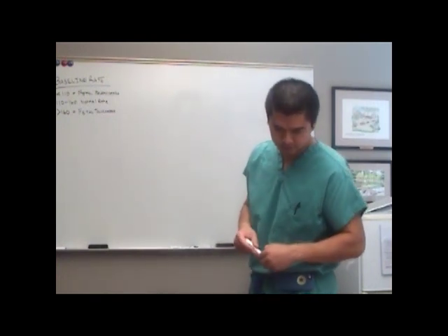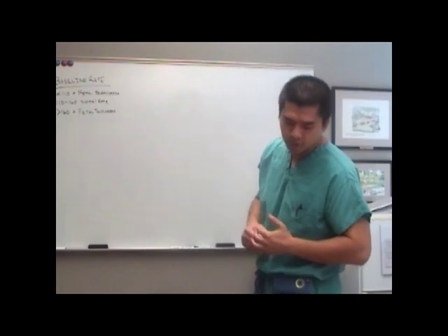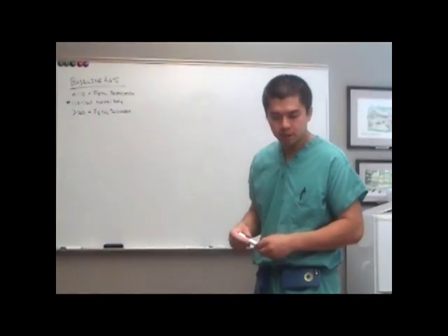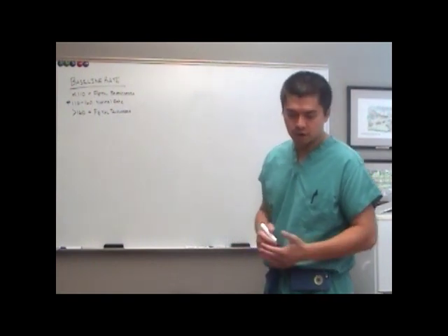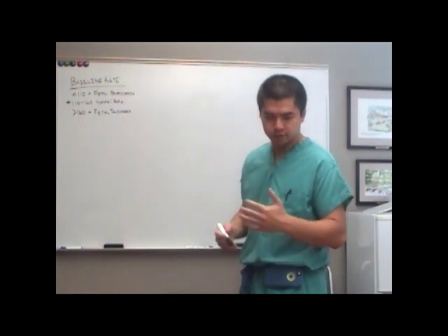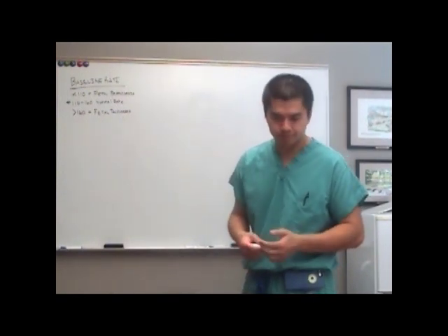So in this example, what would the baseline rate for this patient be? Yep, you could say 130s or 135s. You could argue for either. And again, that's a judgment call. I think you could argue for either one, but just pick a baseline rate and stick with it.